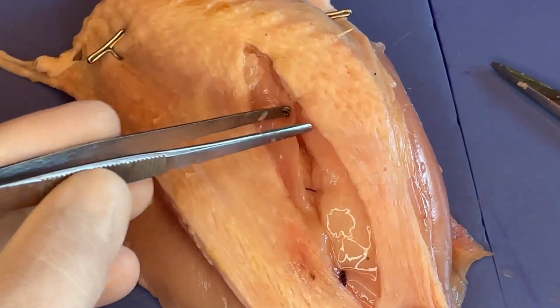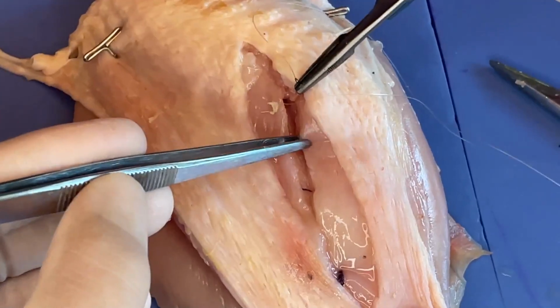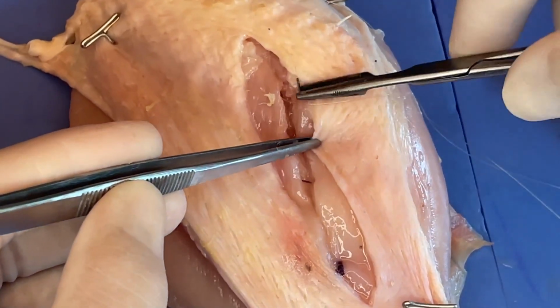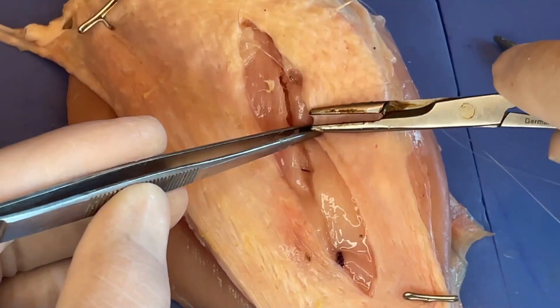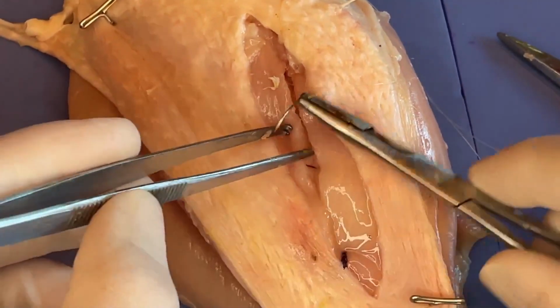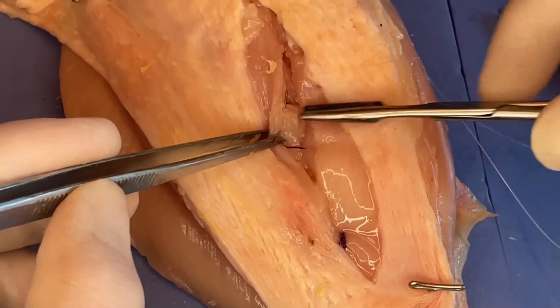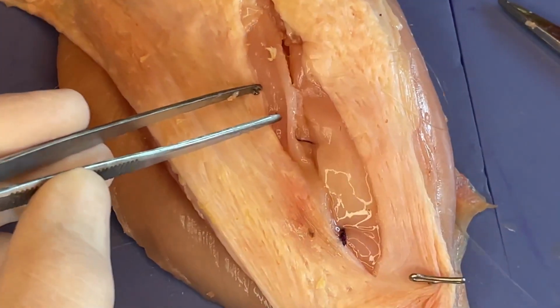And so just back and forth, one side to the next. Come in here, travel down parallel. This side, it seems the skin edges, that skin's a little bit more attached, not a lot, but some. So you can see that I've come out right here, so my next bite would be going in right here. I usually take a couple, two or three bites and then pull it all the way through.